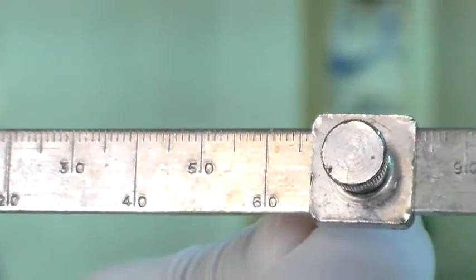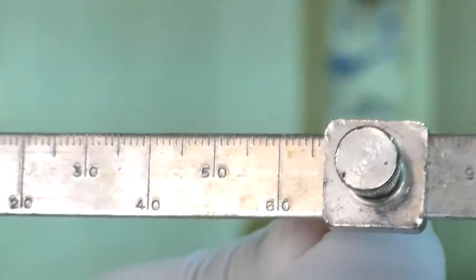My reading again shows 67, so that's a good sign. I'm going to go again for the third time.